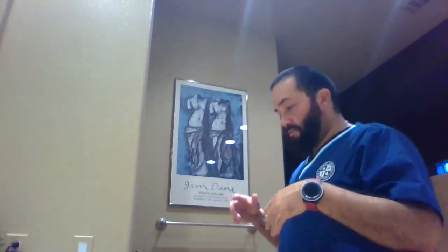So before we begin, or when we start, we would perform hand hygiene, provide patient privacy. We would introduce ourselves. We would use 2 patient identifiers. They will give you your name and date of birth, and then you check their badge. You check for any allergies. You do your environmental safety check. You ensure proper body mechanics for your safety and the patient's safety. You gather all supplies, which I have done.